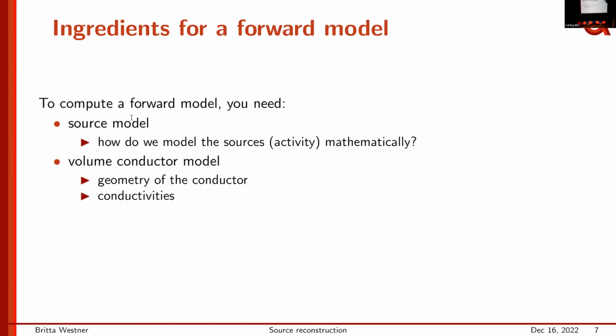You need to know how conductive was the skin, the scalp, all the things that are between the source and your electrode, because that will describe how the current most likely traveled from the source to your electrode, which you need to know to then, just to repeat that again, go the other way from whatever you measured on your electrode to where it most likely originated from.